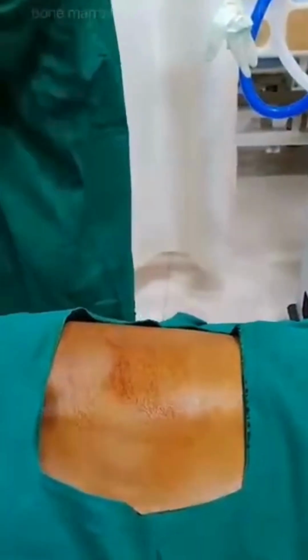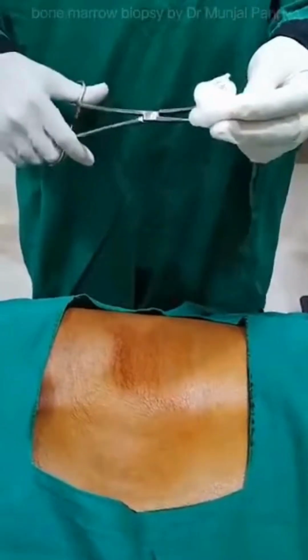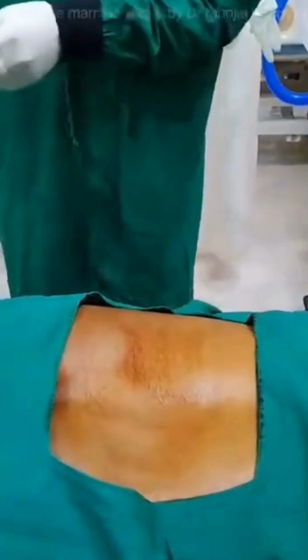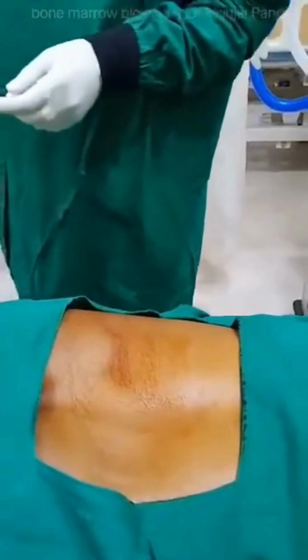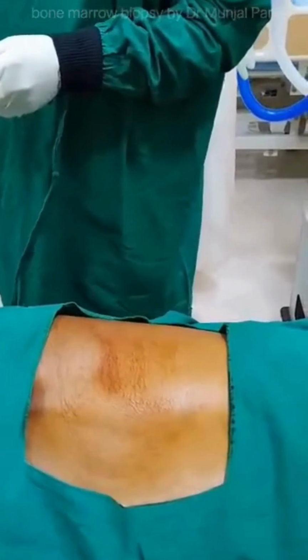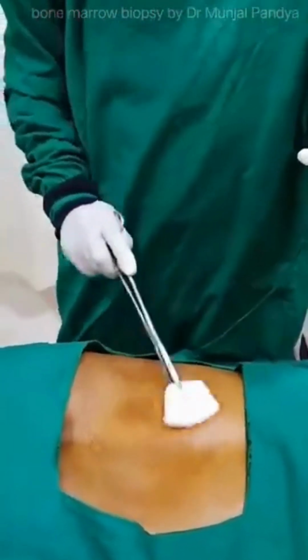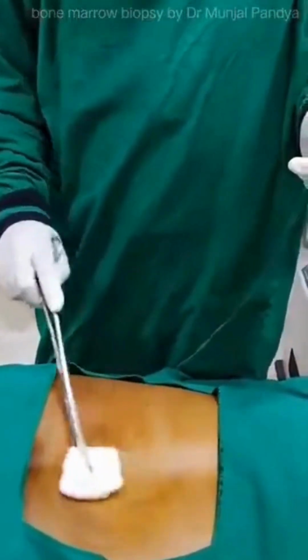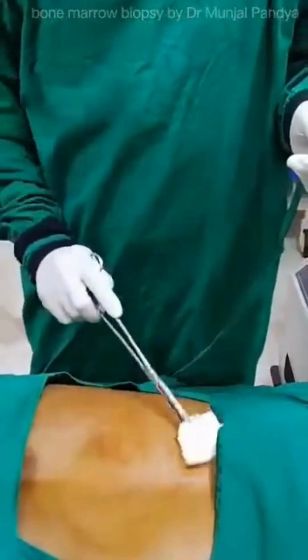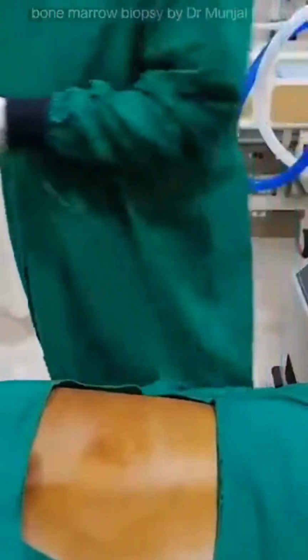This patient has no history of bleeding, but he has a history of headache, and he was evaluated and found to have low platelets. So we are going to do the bone marrow biopsy to find out the cause of low platelets. So after consent and painting and draping, I applied betadine. Now I am applying the sterilium or spirit. You can apply in a circular motion from inside to outside. Don't come from outside to inside, because the outside area is an unsterile area. So I did the painting.